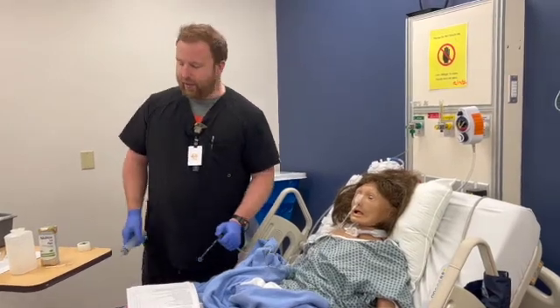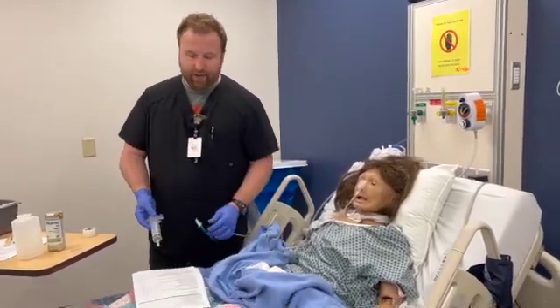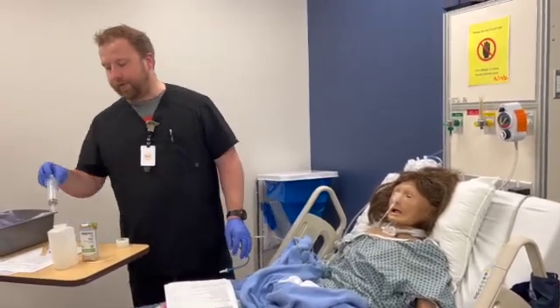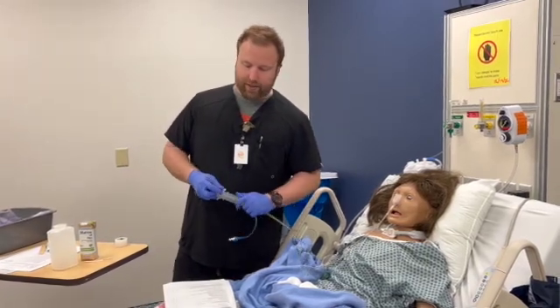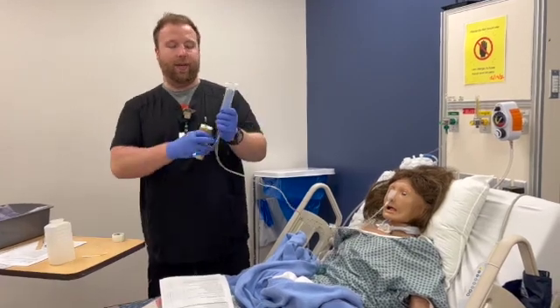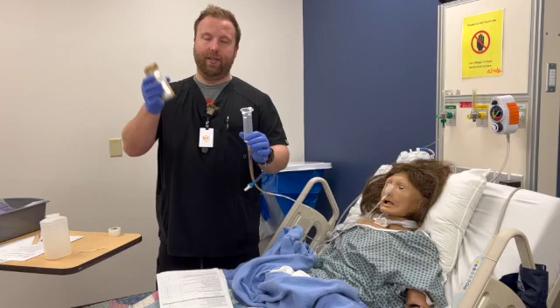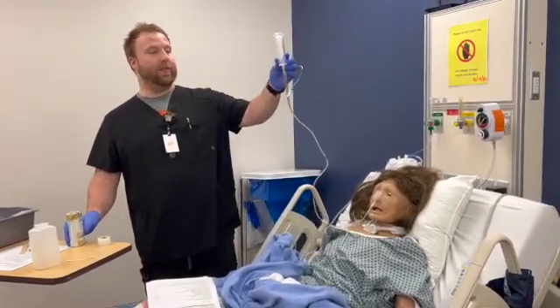Anyways, this will be our first feeding because we just placed the NG tube, and we will flush the tube with the appropriate amount of water. According to our orders, it should be 30 to 60. We'll give 30 for the flush, and then I want to remove my plunger. I'm going to have this in here, and I'm going to pour until this is empty because there's only 240 left. As I go higher, the tube feeding goes in faster.